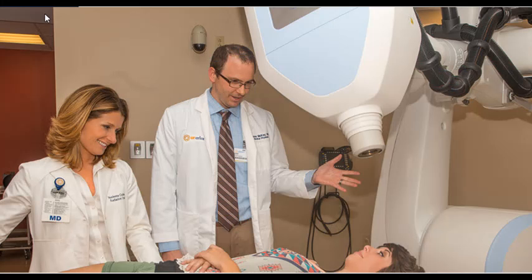A lot of times, due to this high consequential nature of SBRT, the therapist is not alone in delivering. Many times, and I think it's by nature of what we're doing, I can't imagine it being another way, the physician needs to be present during the decision to accept the imaging. So after the cone beam, say, has been acquired, alignment will occur. The physician accepts the current alignment the way it is, and then delivery is initiated by the therapist. And physician and physics need to be present, at least in my experience, and I'd be surprised if that's not true universally.